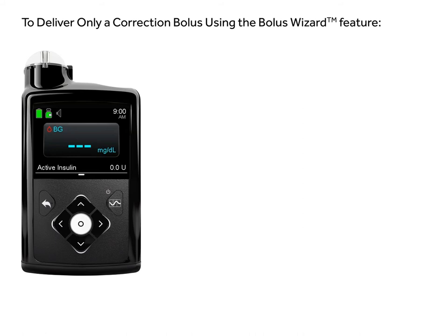This video will show you how to deliver a correction bolus using the bolus wizard feature on your pump.